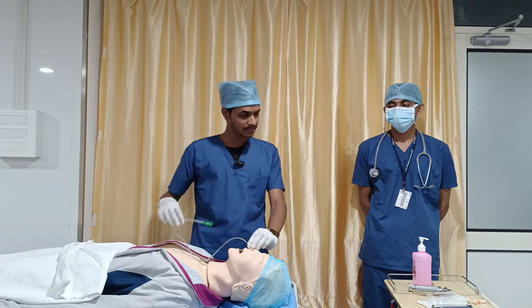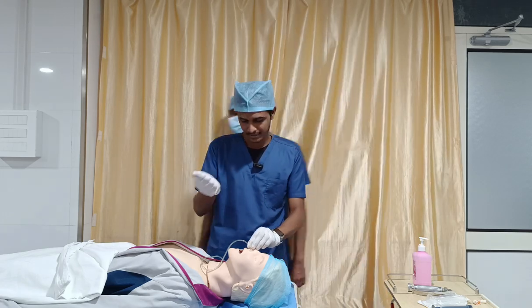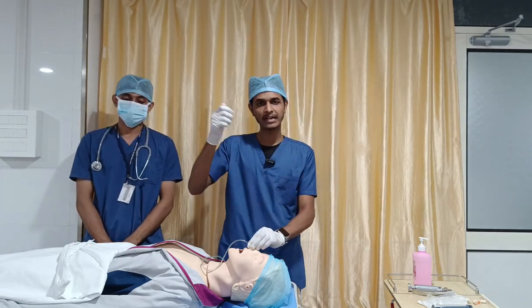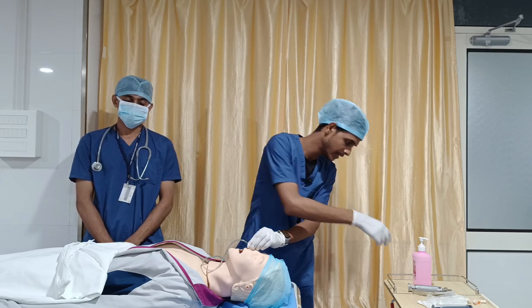If the person is intubated, gently you can use the laryngoscope, and then with the help of Magill's forceps you can guide your Ryle's tube into the esophagus. That is also one of the techniques.